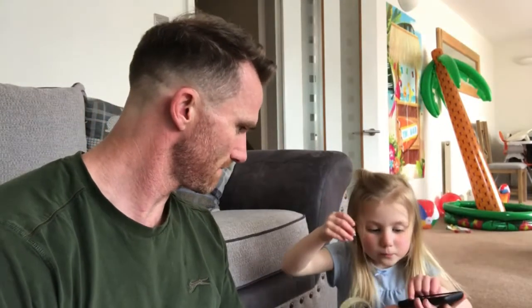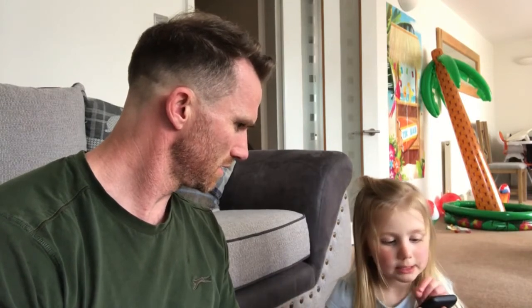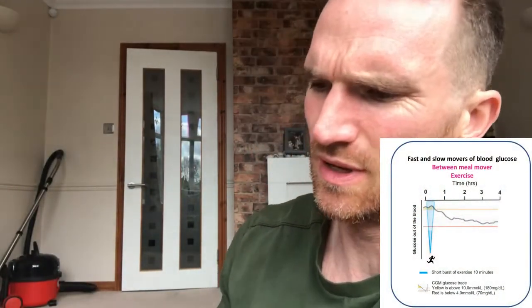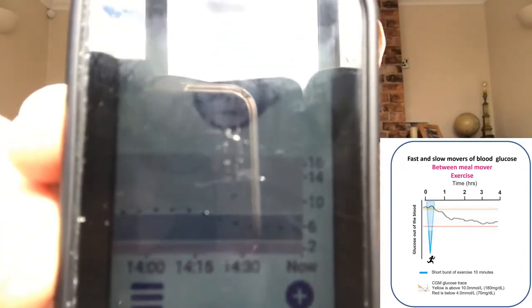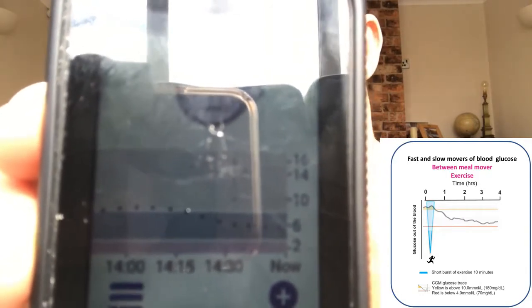It's now half past. I'm just going to check the CGM. What does it say, Grace? It says 6.0. Is that good? Yeah, 6.0 — as predicted! We'll see how it is in another 10 minutes. So about half an hour on now from when I did the exercise, the exercise should have finished doing its job. You can see it's 5.5 and stable. You can also see on here that at two o'clock is roughly where the high alarm went off, and within 15 to 20 minutes it was down — it's only taken half an hour to steady out.